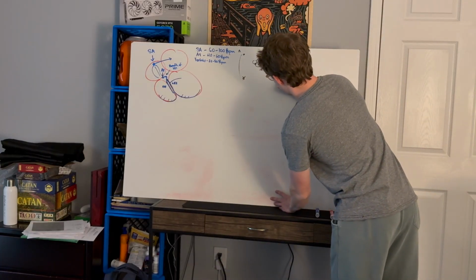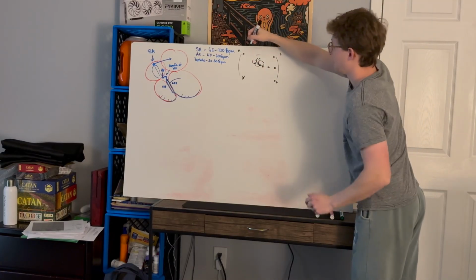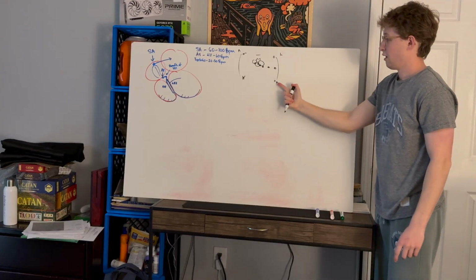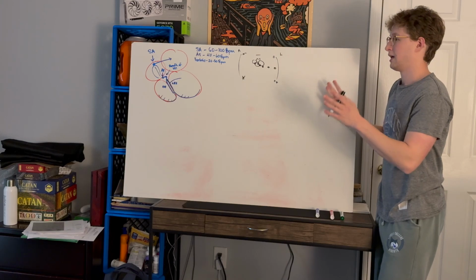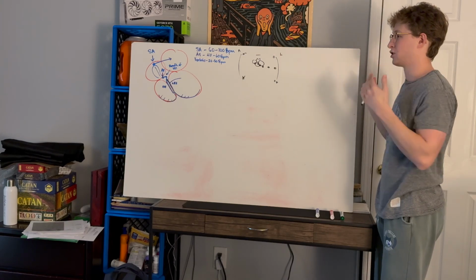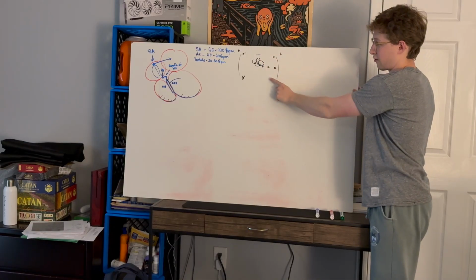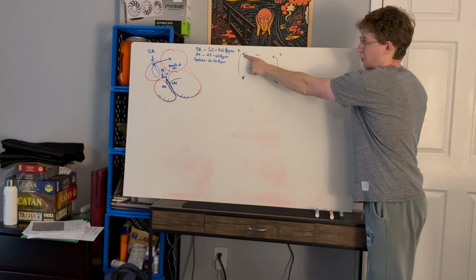Then it takes the right arm and sets it to negative. So this positive electrode is the viewing angle. It's where your face is. Imagine you are standing right here looking at the heart. You're basically looking at the apex, straight through the center of the heart, up to the right arm.